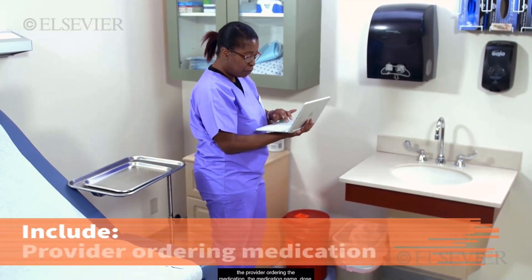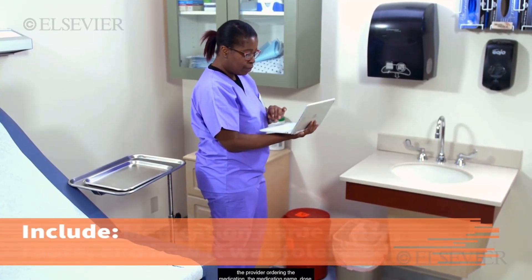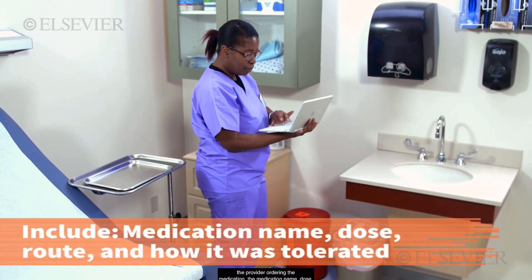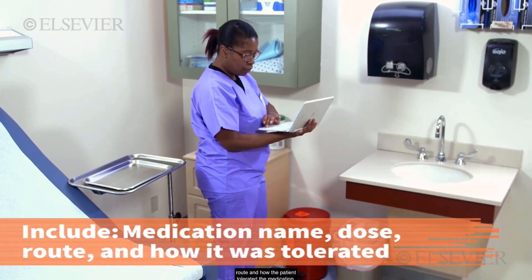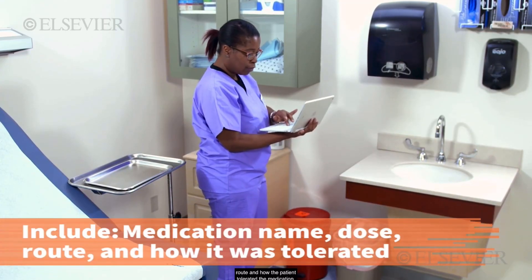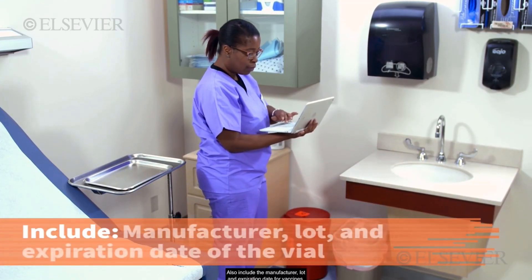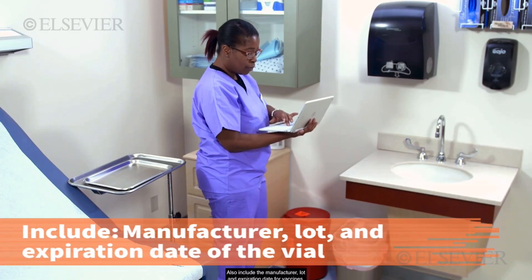Also document the provider ordering the medication, the medication name, dose, route, and how the patient tolerated the medication. Also include the manufacturer, lot, and expiration date for vaccines.